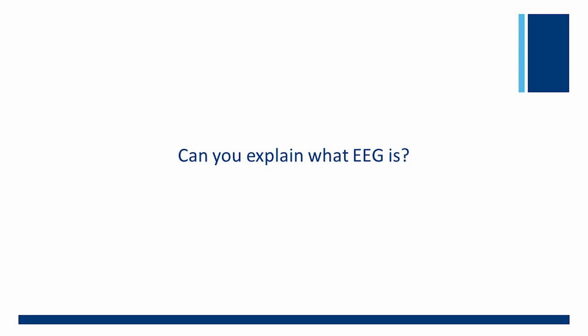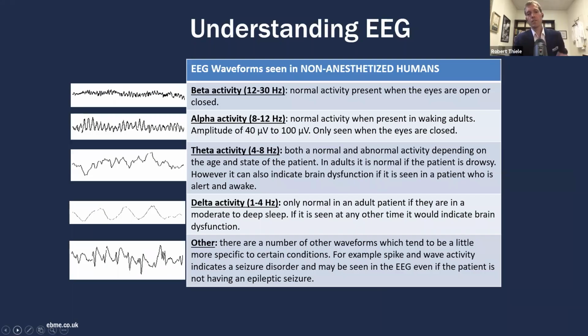For this segment of the series, a discussion on anesthesia in the brain, we will dive into what EEG is. To help provide insight into this is Dr. Bob Thiele, Assistant Professor and Co-Director Enhanced Recovery After Surgery Program at the University of Virginia. Starting out with non-anesthetized patients, which is how EEG was originally developed. It wasn't developed to study intraoperative awareness. It was developed to study sleep and consciousness and things like that.